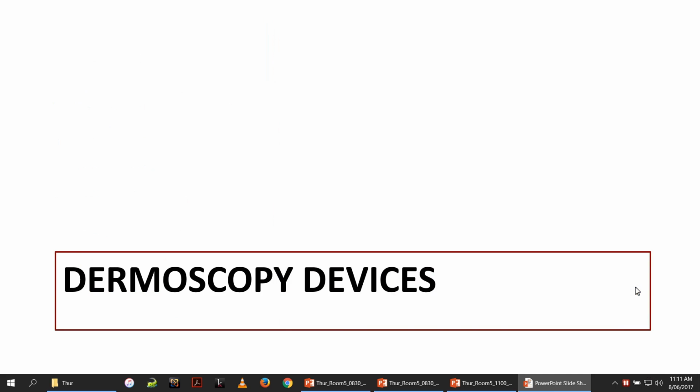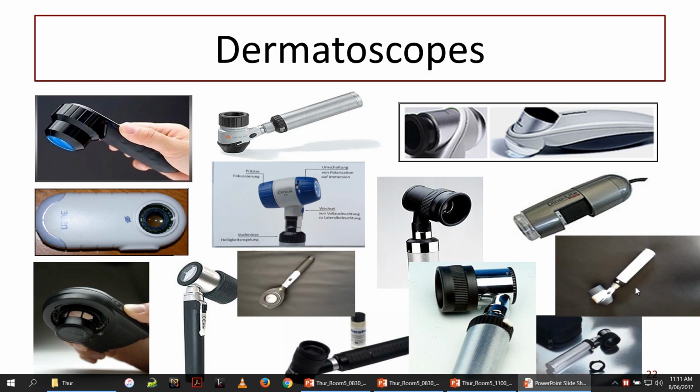Now, I'm very conscious that some of you are beginners. Can we have a show of hands of who considers themselves a beginner? Okay, that's most of you, so that's great. I will be moving fairly fast through this, but there are plenty of resources for you to gather information, and I believe this is recorded so that you can keep listening if you really must. I have a selection of dermatoscopes on the table over there, and we'll be happy to demonstrate any of those at lunchtime. There are more and more, so this picture is becoming crowded and I can't fit any more on.